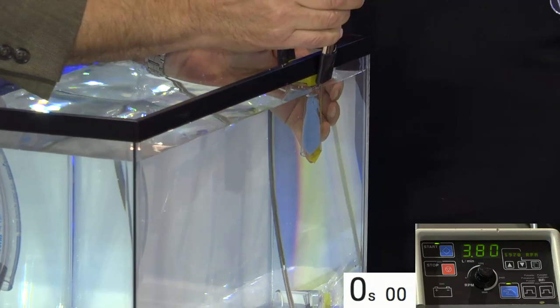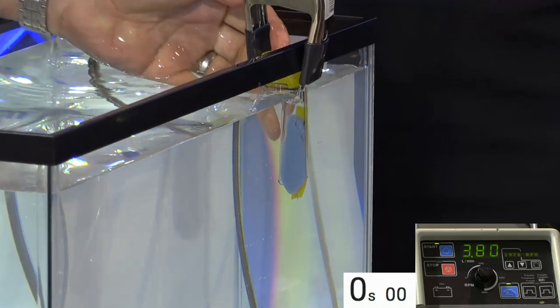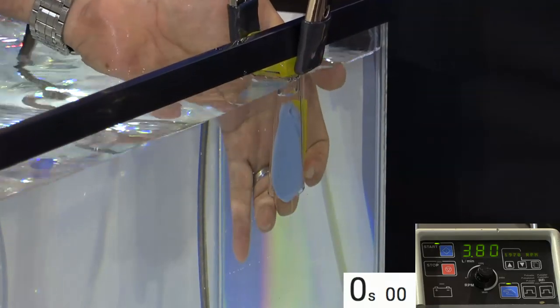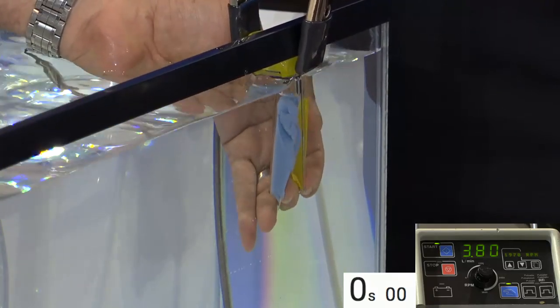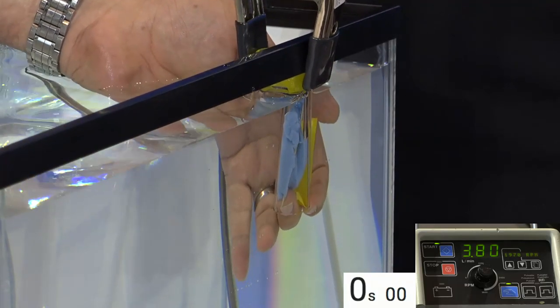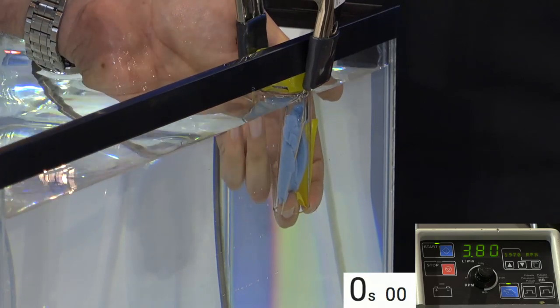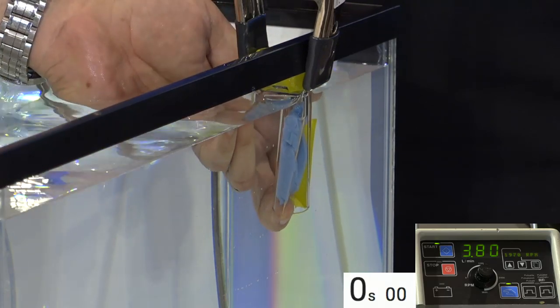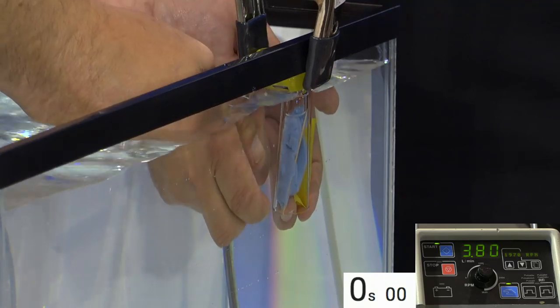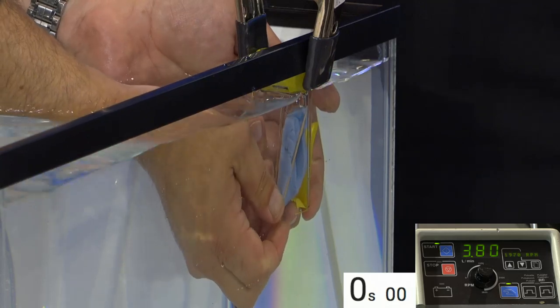Now, I'm going to set this up if I can, Joe. What you're going to see whenever you get to a piece that's this large is that it is going to take a little while to pull it into the inner diameter of the cannula. We want that to happen. The second thing that's going to happen is that the clot will actually, once it engages, wrap around the outside of the funnel, which will help to prevent a little bit of this.